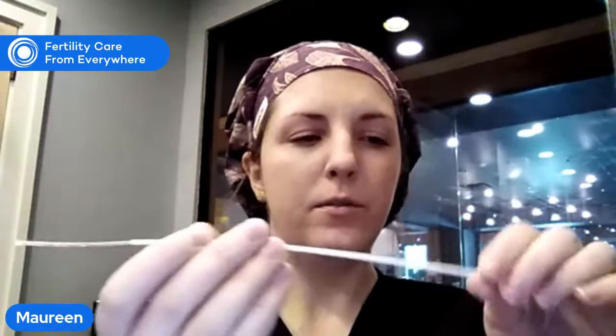So this is a catheter here. This is actually, it's not this big. So this is our outer protective layer. The end of the catheter where we load the embryo is quite flexible, and this little bit stiffer part is what passes through the cervix. We are actually giving the doctor just this inside part, so he's doing that trial embryo catheter. He's putting this stiffer part in, and then we come in with this, which they sometimes call the noodle. There's not really a great name for it. And that's what we're threading into the outer catheter.